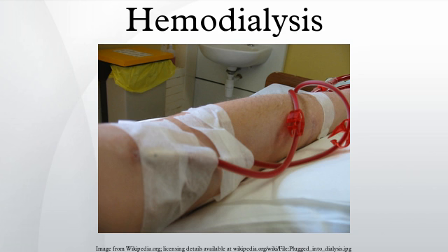AV fistula. AV fistulas are recognized as the preferred access method. To create a fistula, a vascular surgeon joins an artery and a vein together through anastomosis. Since this bypasses the capillaries, blood flows rapidly through the fistula. One can feel this by placing one's finger over a mature fistula. This is called feeling for thrill, and produces a distinct buzzing feeling over the fistula. One can also listen through a stethoscope for the sound of the blood washing through the fistula, a sound called bruit.